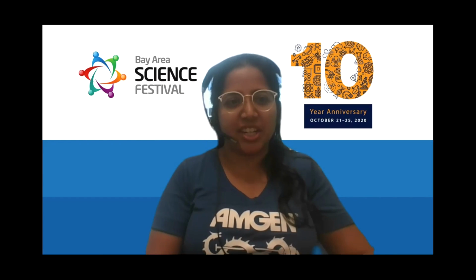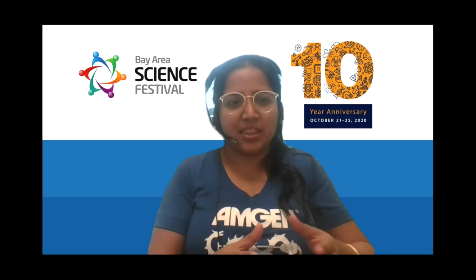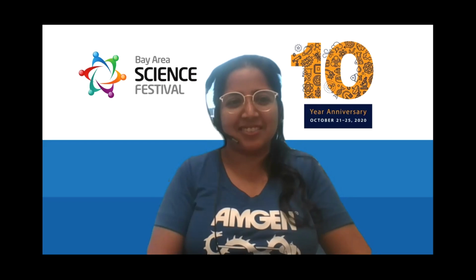Yeah, so as Prati covered in an earlier question, and also as it's shown in the video, the liquids essentially have all the nutrients and ingredients that are essential to keep the cells that we are growing out of their own system in this artificial setup. We need to give them all they need: amino acids, glutamine, things like that, and vitamins for their growth. It also has a pH indicator in the color, as Carlos mentioned earlier.